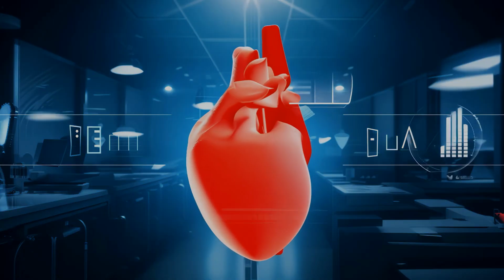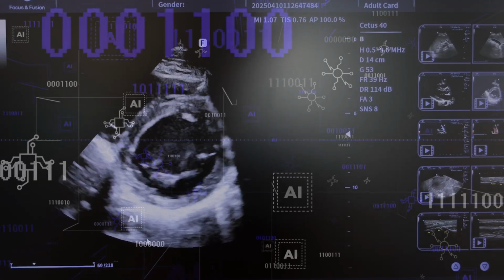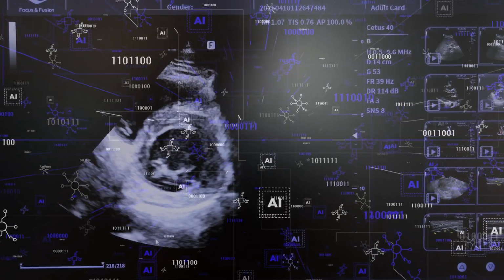If we take that a step further and take that data and process this multitude of pixels from this CAT scan data, it can be very time consuming to look at it in detail. If we process that with AI and get it automated, then that large amount of data can be analyzed quickly, oftentimes in minutes to hours. What we see with the CAT scan data is the exact degree of stenosis down to the percent of the plaque. So stenosis meaning how much it narrows inside the artery.